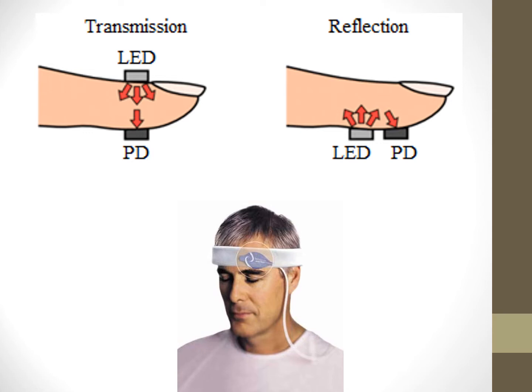The pulse ox here is a forehead pulse ox. It's usually right over the eyebrow. And there's lots of good surface perfusion in the scalp. If you've ever seen a scalp bleed or scalp lacerations, you know they bleed quite a bit. So there's a lot of blood vessels in the scalp area, and so we can reflect pulse oximetry pretty darn accurately.